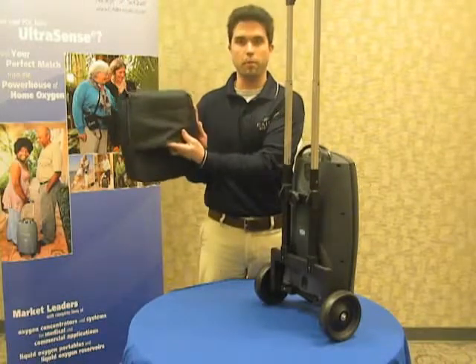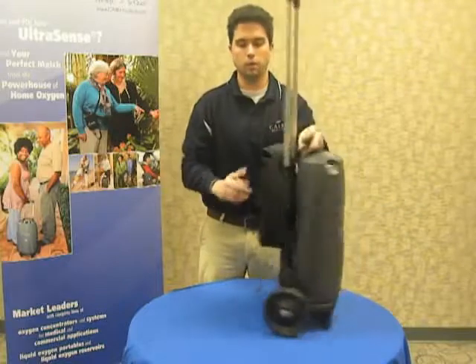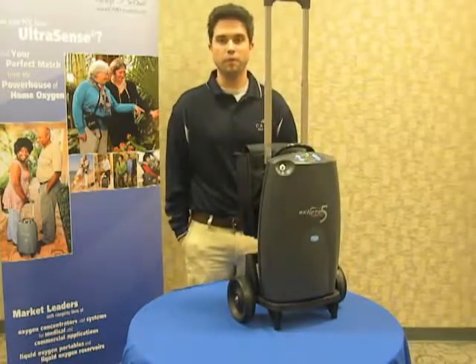And then find the strap on the back of the accessory bag and slide it over the cart handle. And once you insert your accessories in there, you're ready to go and enjoy life freely with your SeQual Eclipse 5.